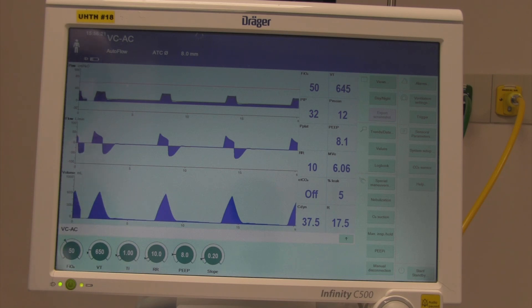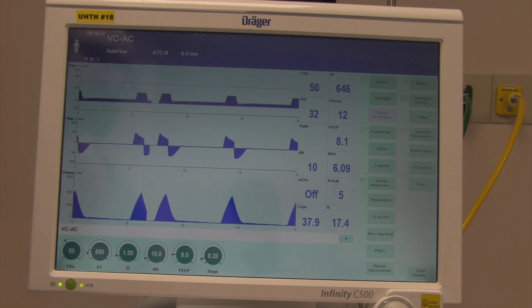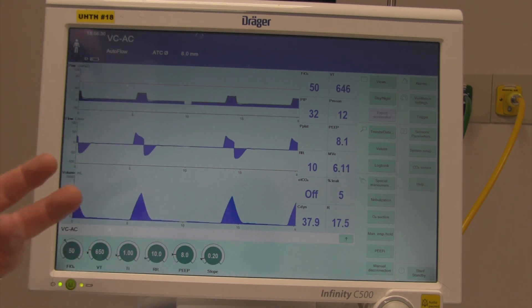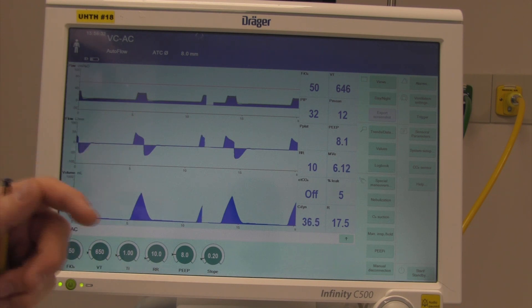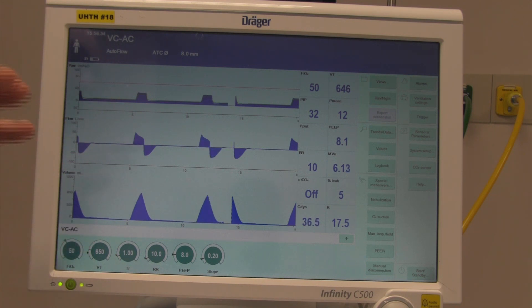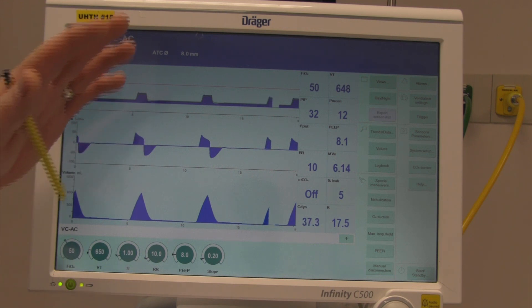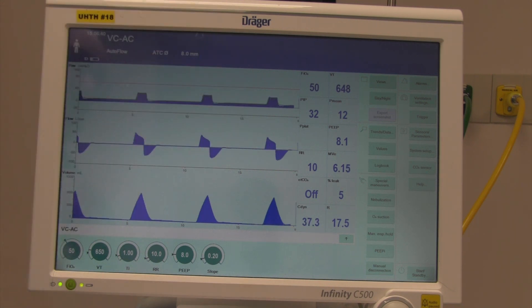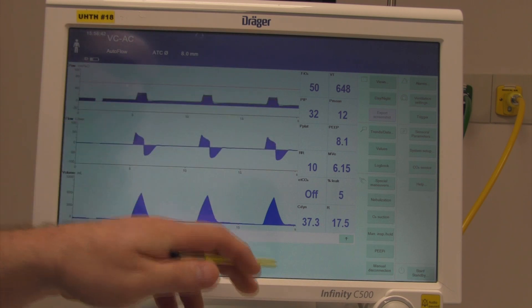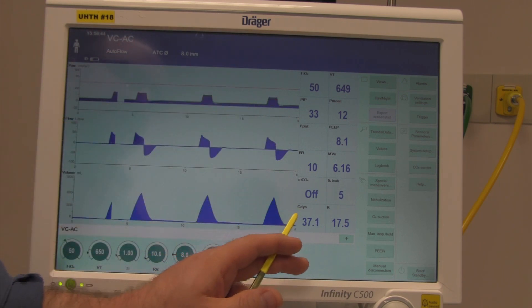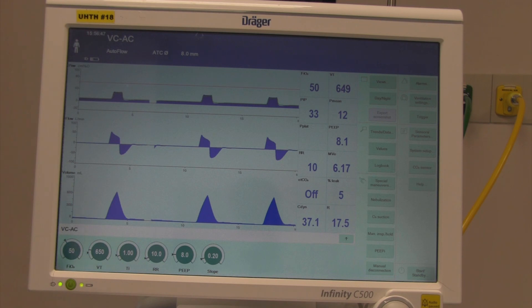Dynamic compliance can change almost breath-to-breath — it can really change with wheezing, mucus secretions, or a patient biting the tube. Static compliance, on the other hand, I like to compare almost to the bicarb: it doesn't usually move fast, it trends in different directions over time. Cdyn, calculated right here, can change a lot from breath to breath — if the patient coughs, it changes significantly.